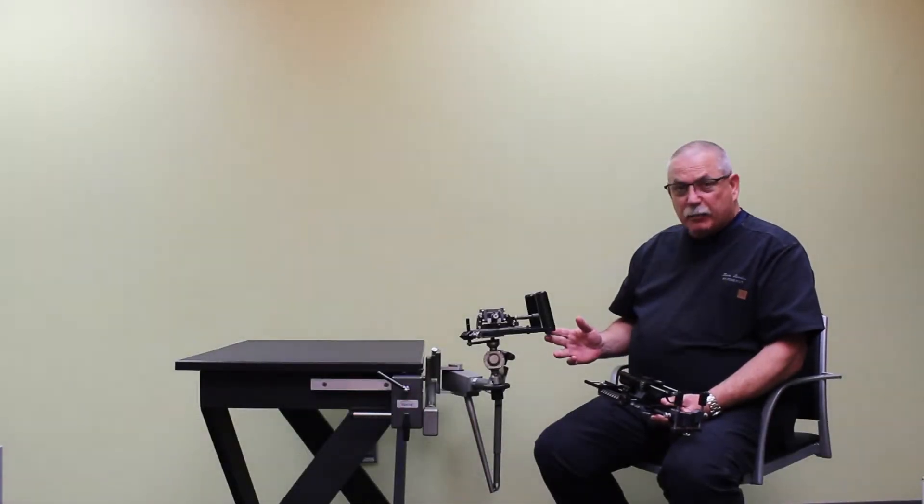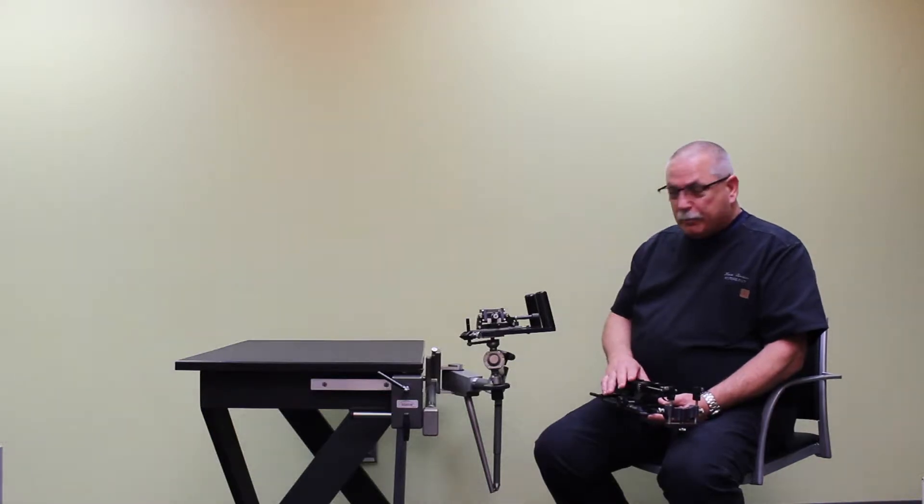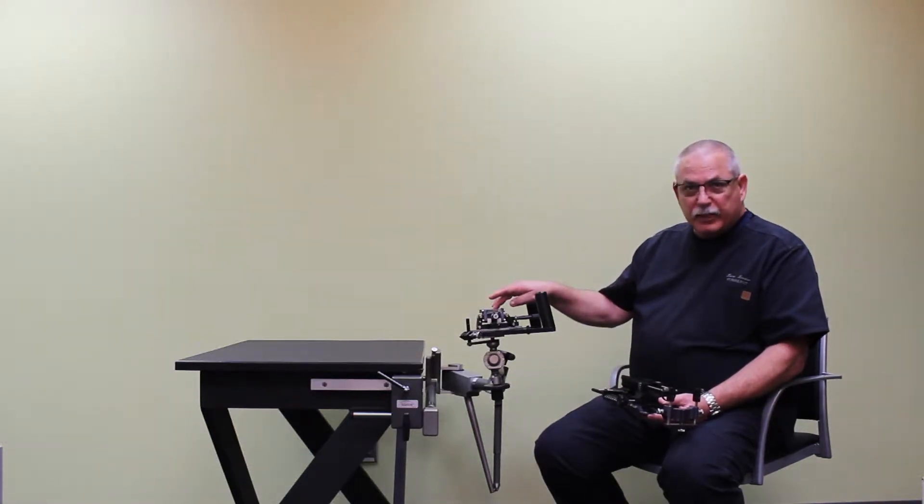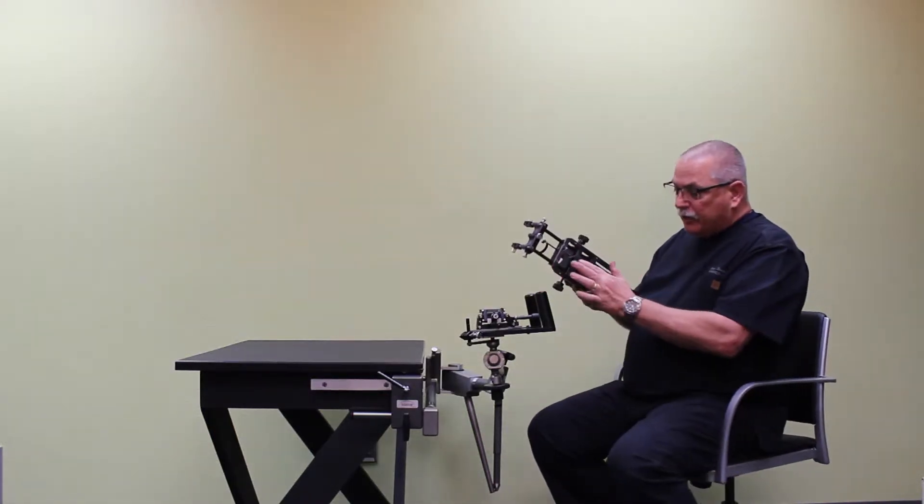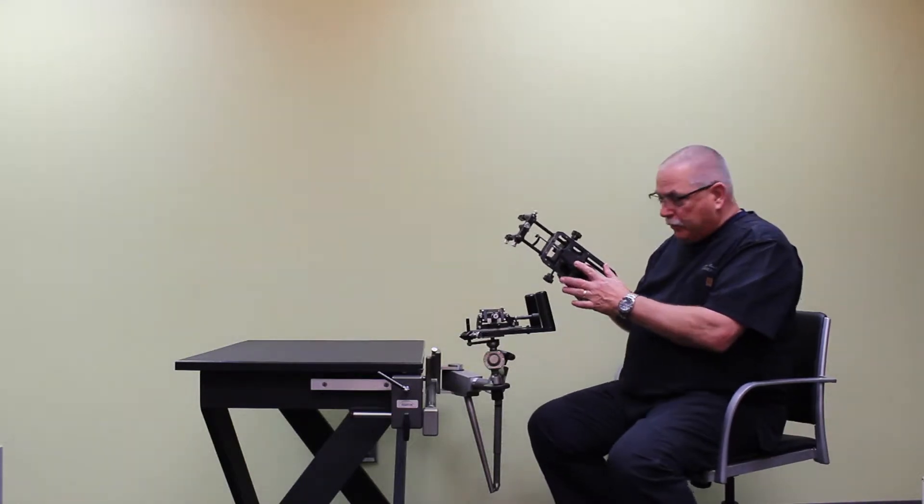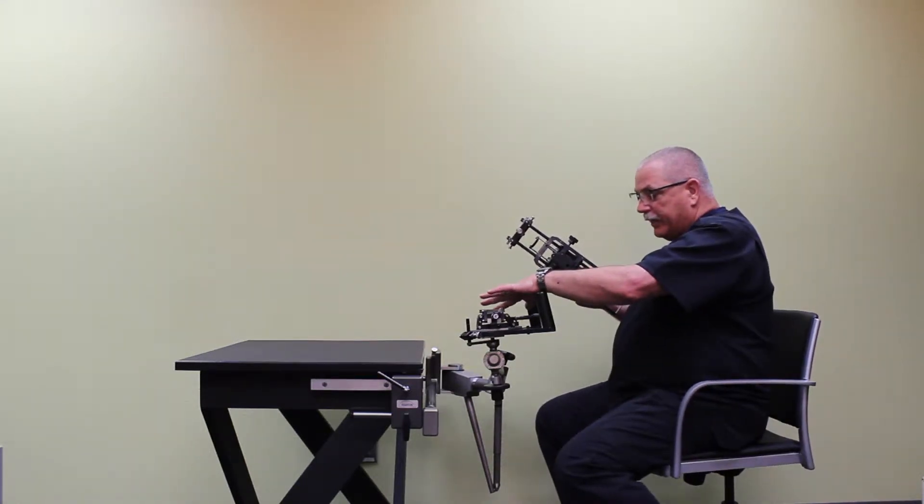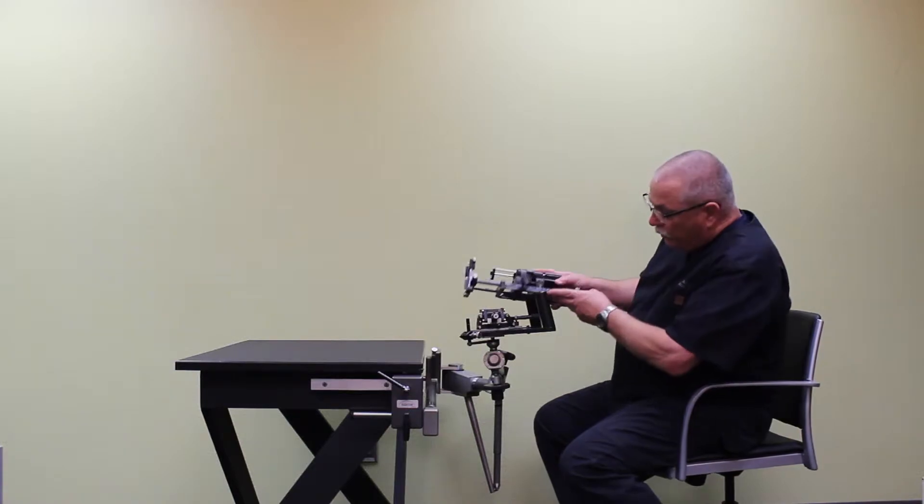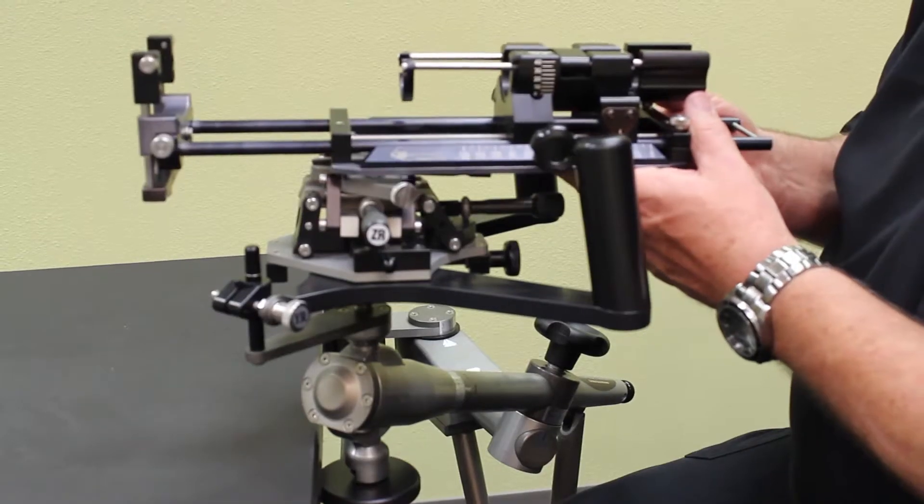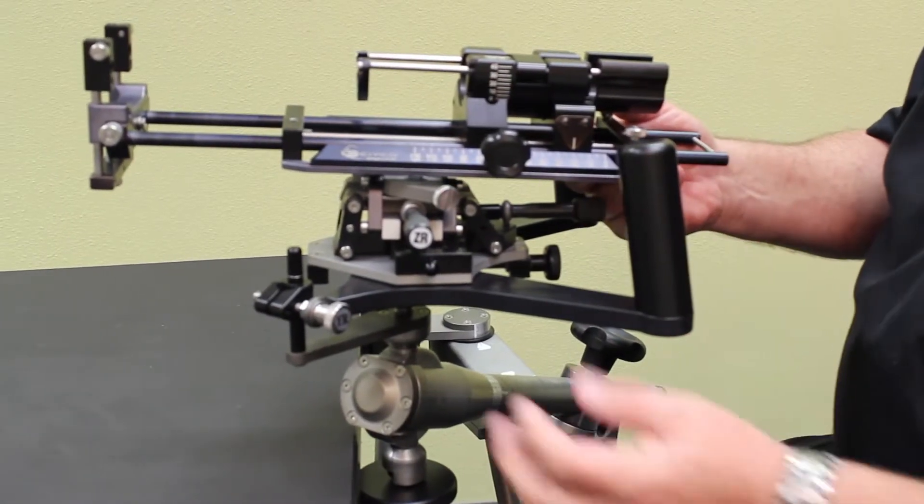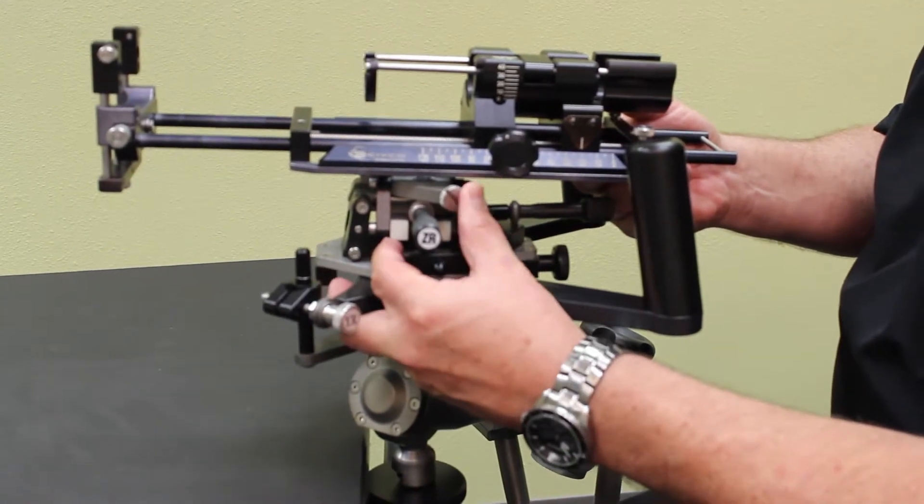Now that we've attached the stabilizer to the table, the next step is to attach your classic stepper onto the micro touch stabilizer. You'll notice a triangular shaped plate on the bottom of the stepper and also a triangular shaped plate on the top of the stabilizer. We want to slide one into the other, and then using this knob, we'll tighten it down.